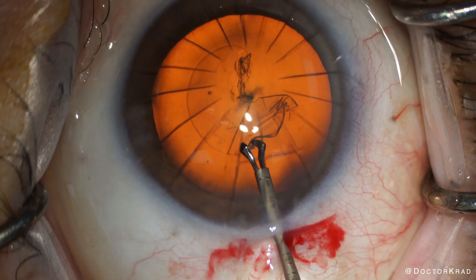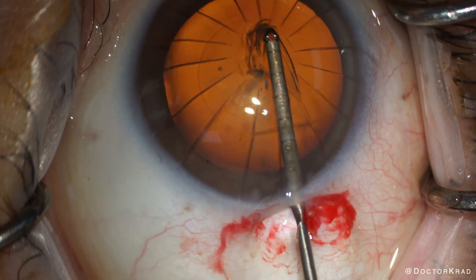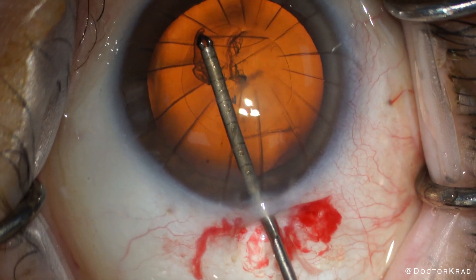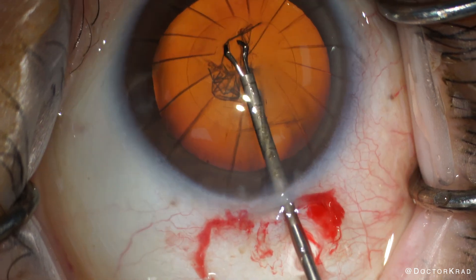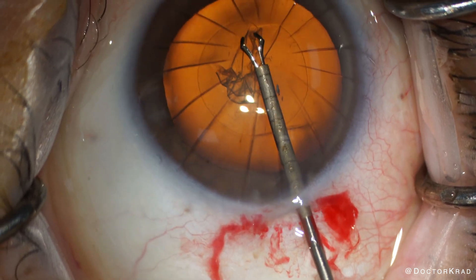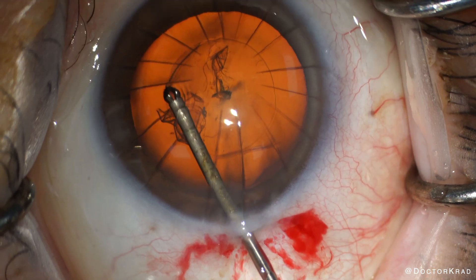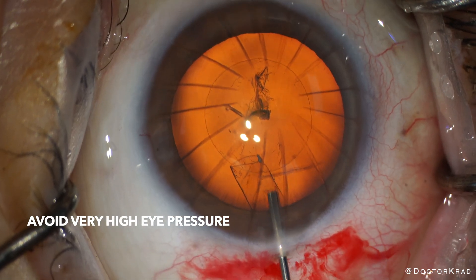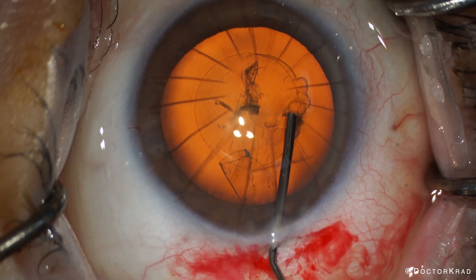Here I'm performing the capsulorhexis, which is when we tear a round opening in the capsule of the cataract. We will remove the cataract through this opening. Other considerations in patients who have had RK surgery in the past is to avoid increasing the eye pressure too much during surgery — you want to avoid stressing the previous RK cuts.